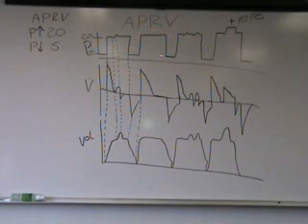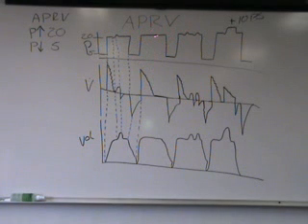This second breath, I just demonstrated, the person didn't breathe spontaneously. It looks identical to a pressure-controlled breath, doesn't it? The pressure level goes from the low to the high, the flow rate decelerates to 0, and the volume stays in until the end of that I time, in which the person exhales and the volume comes back out.